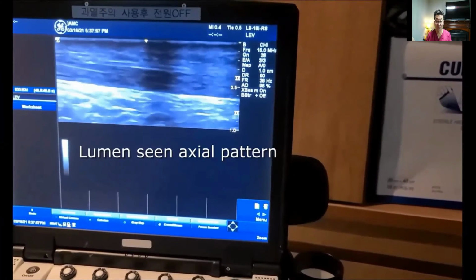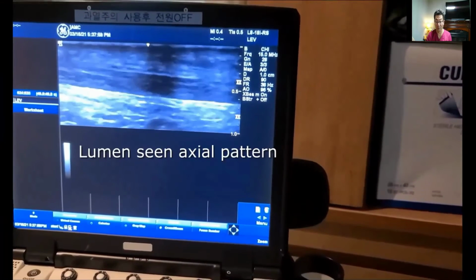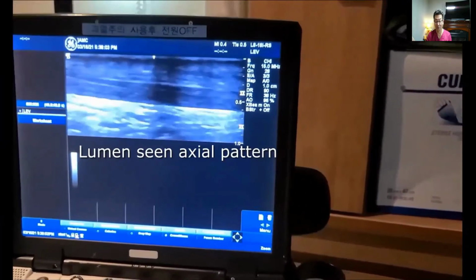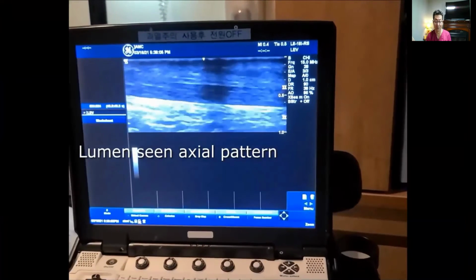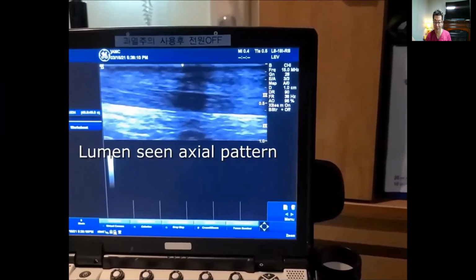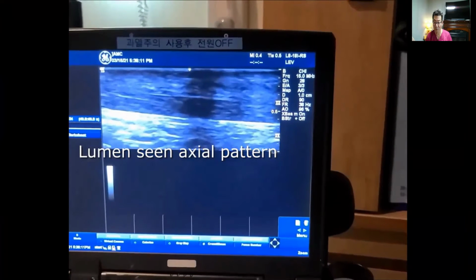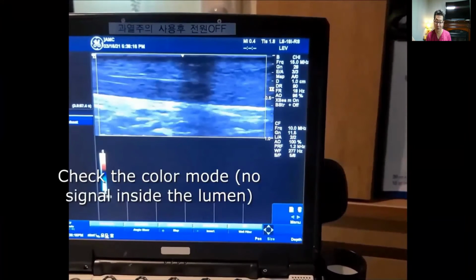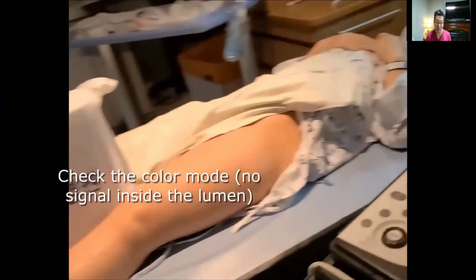Once you see that opaque linear pattern, then we want to convert it into the transverse pattern and ultimately try to map out and diagnose whether or not this lymphatic vessel is functioning. In order to do that, you have to rule out whether or not that is a vein branch.